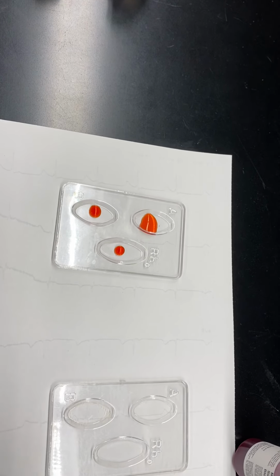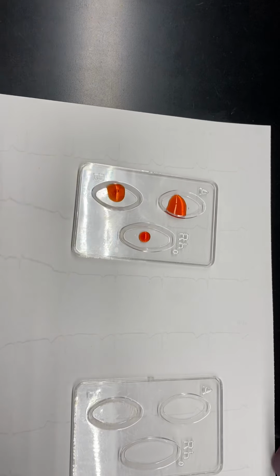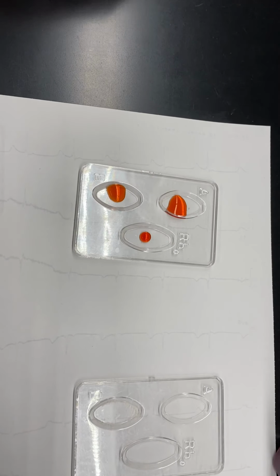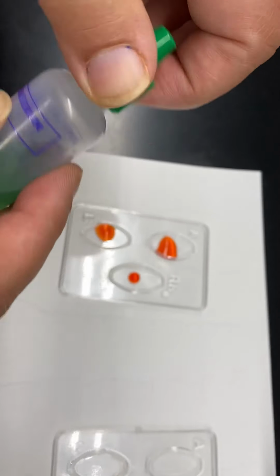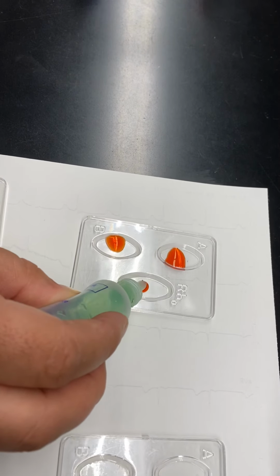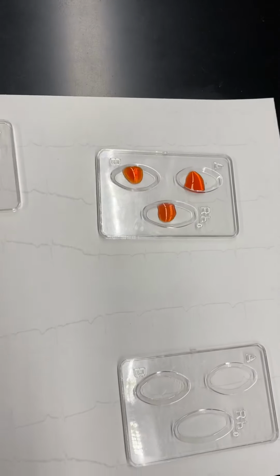To the one that has the letter B, I'm gonna add my anti-B serum. So here's my anti-B serum. And lastly, to the one that is the RH, I'm gonna add the RH one. So here it is. Now I'm gonna mix my sample.